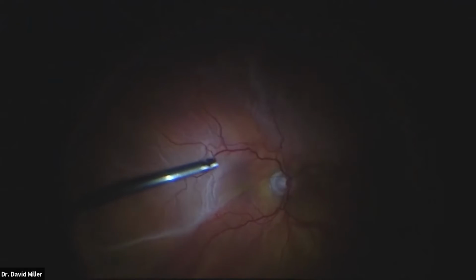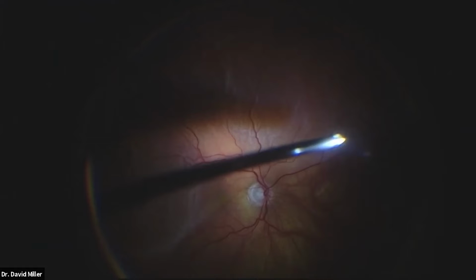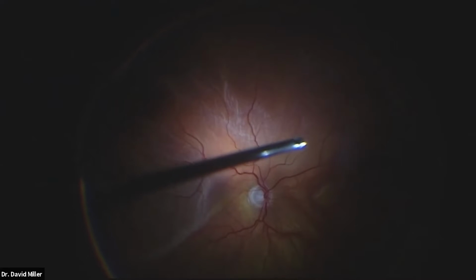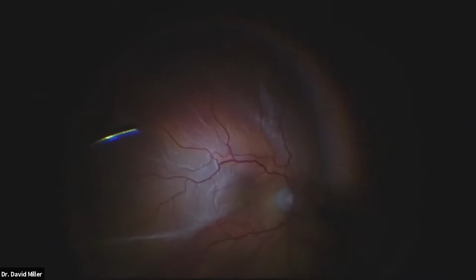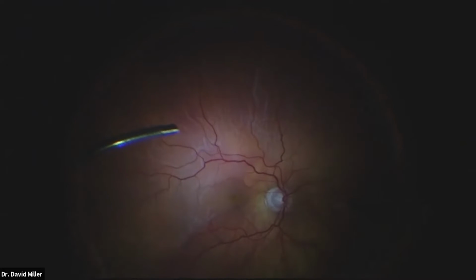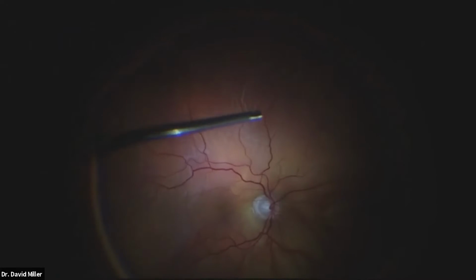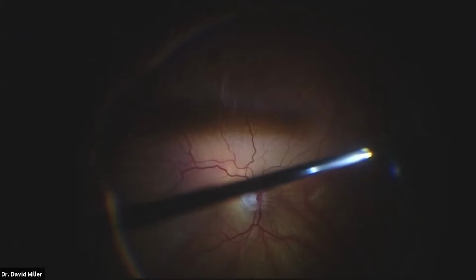So we're gonna let the eye kind of re-inflate. Mike's gonna bump the pressure up for me a little bit. I suspect the bed's high, or the bottle's not high enough. Because I normally don't sit this high.